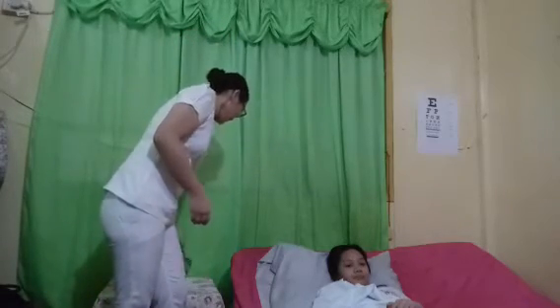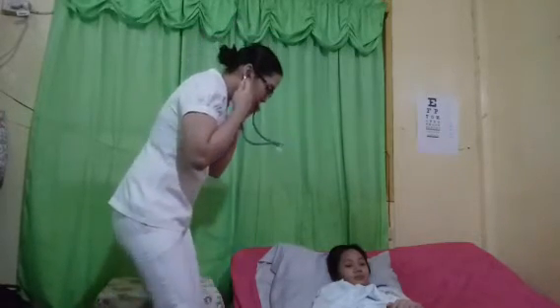Now I'm going to be auscultating the patient's aortic, pulmonic, tricuspid, and apical area for heart sounds, extra sounds, or murmurs. In doing that, I'm going to use a diaphragm and a bell of the stethoscope. But first, I'm going to use the diaphragm of the stethoscope. Okay, Miss Yami, just do regular breathing.